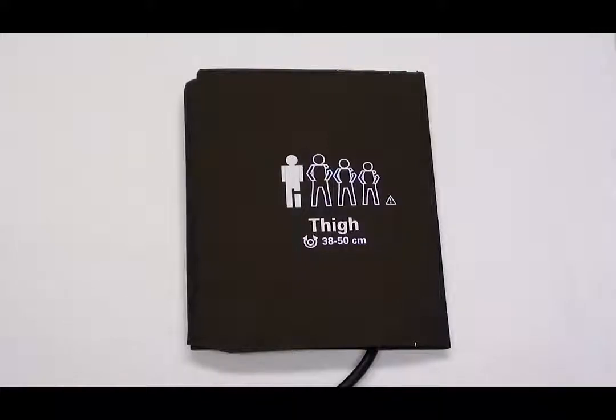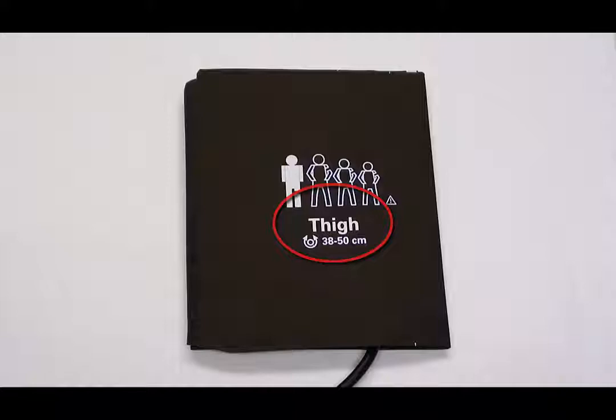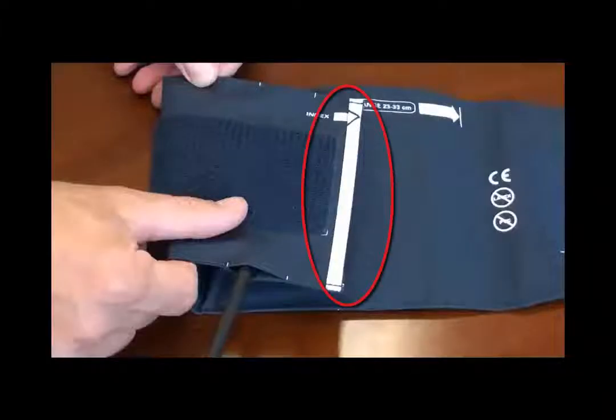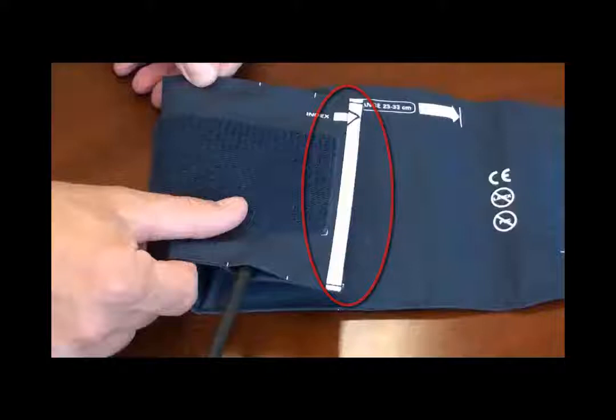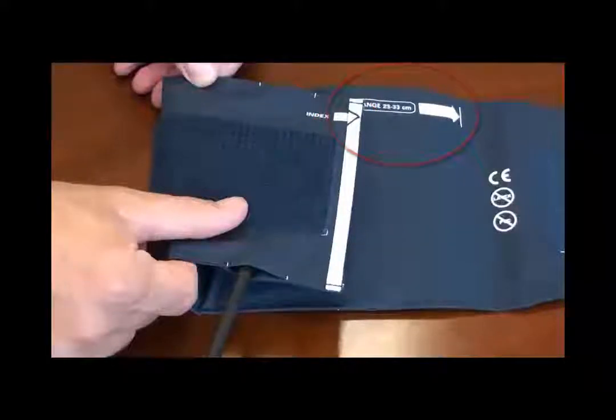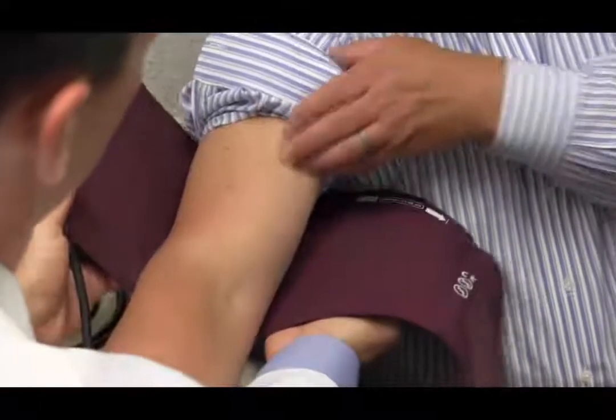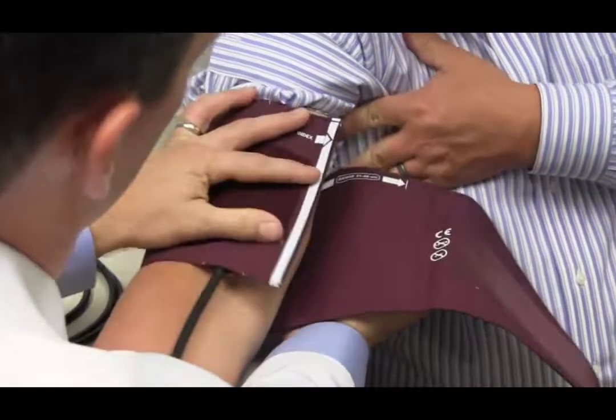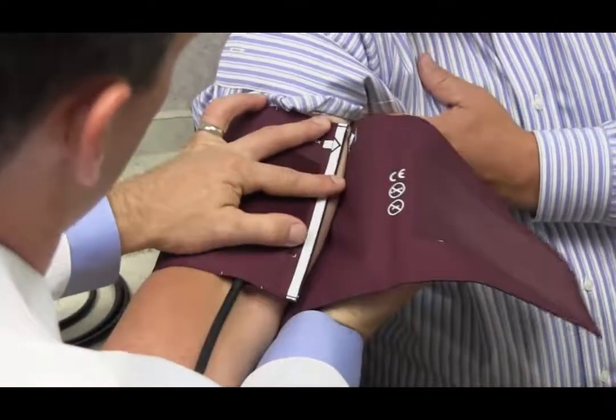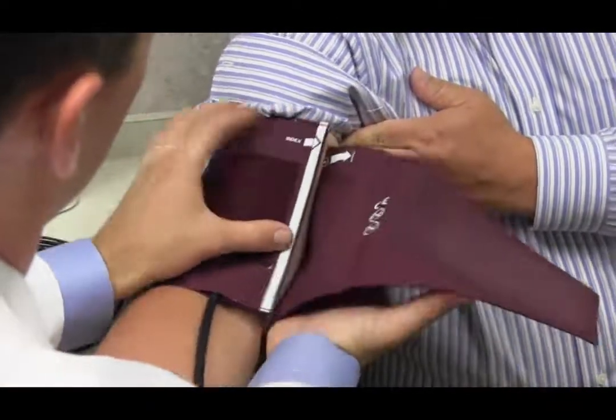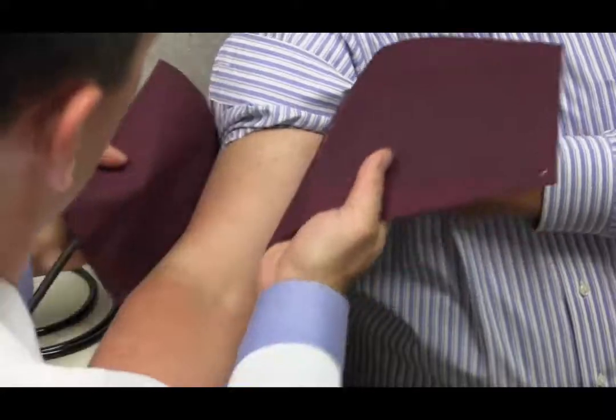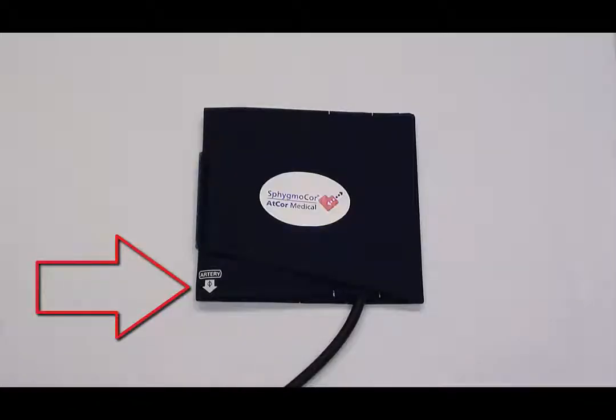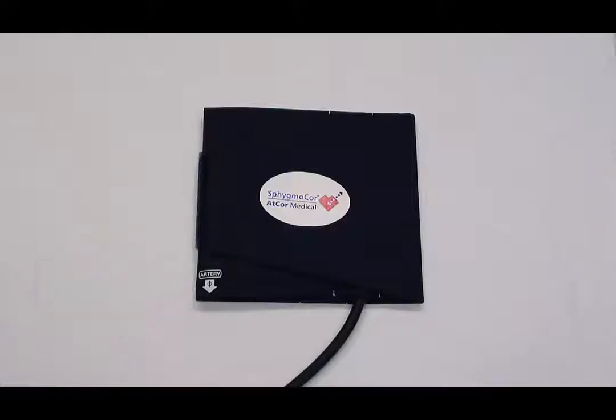Note that the brown cuff has a thigh label. However, this cuff is only to be used on the upper arm for pulse wave analysis assessments. On the inside of each cuff, there is an index marker as well as a range indicator. When the cuff is placed on the patient's upper arm, the index marker should fall within the labeled range indicating the appropriately sized cuff has been selected. An artery marker is displayed on the cuff to ensure proper orientation when placed on the patient's arm.